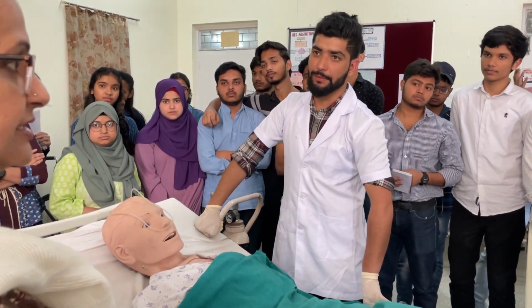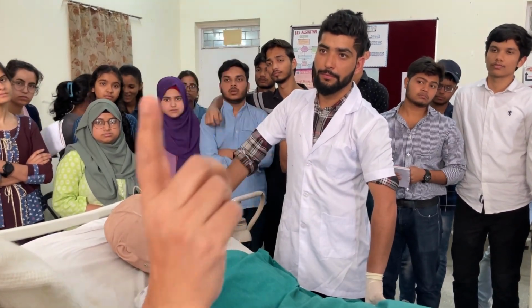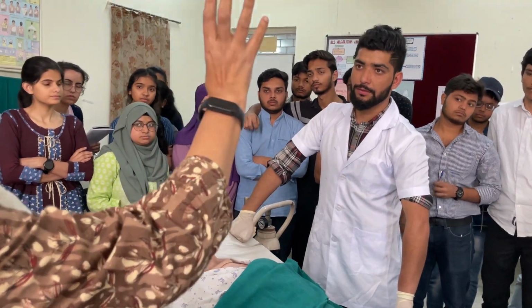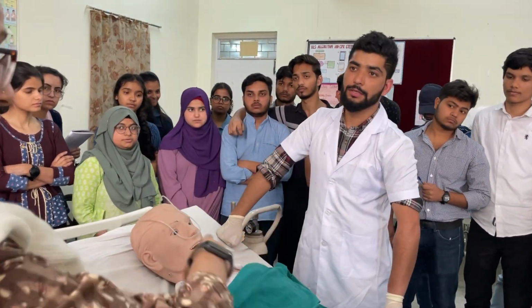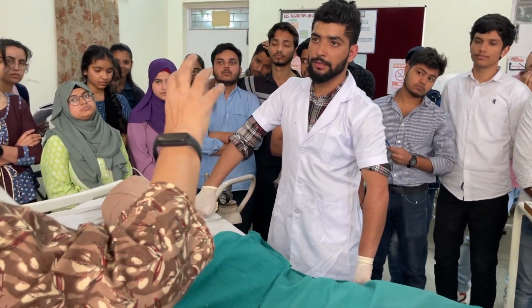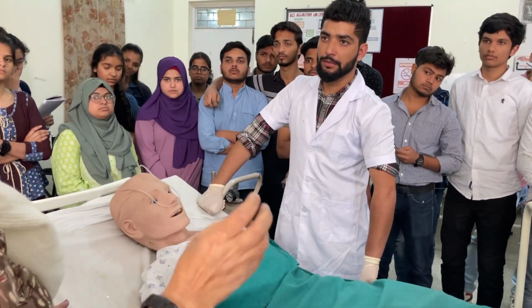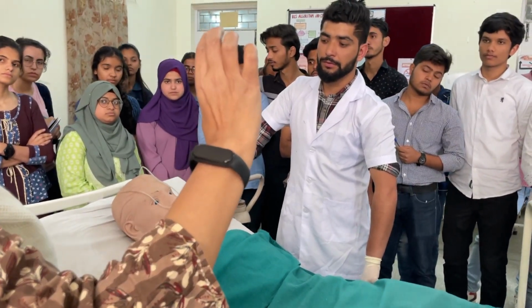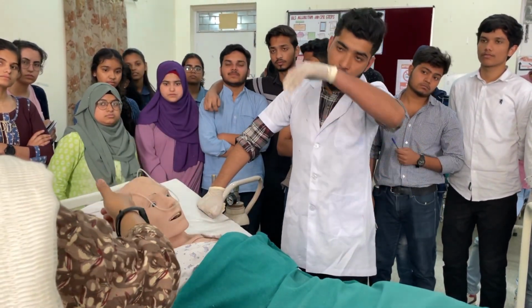Central supply you have seen. Which color pipe? Yellow pipe. In that, only you will find the humidifier, not the cylinder, nothing. Only the humidifier. You have to just clean it outside and take the bottle, wash it nicely, pour the solution. How much? Half only. Okay. And then you have to fix it.